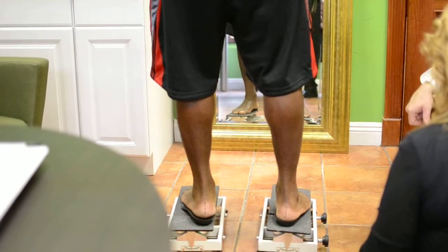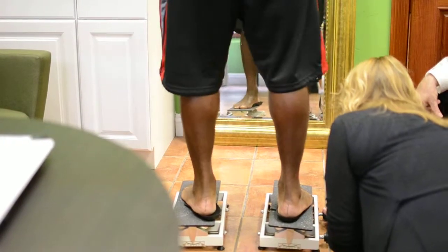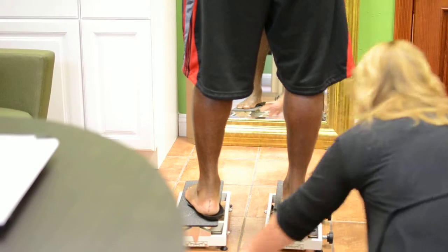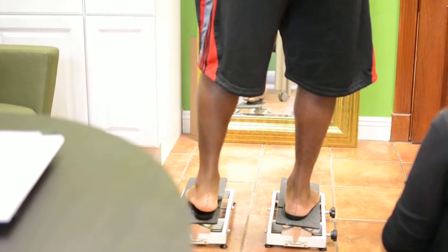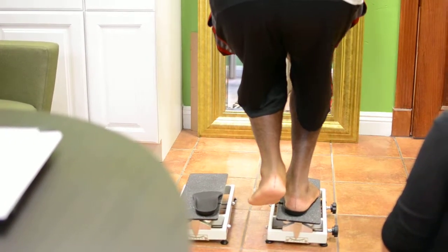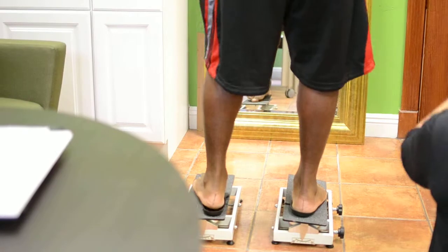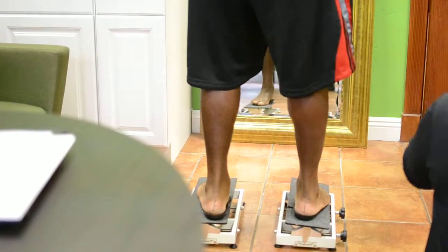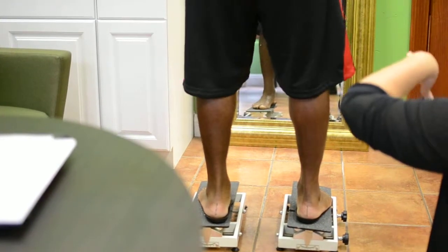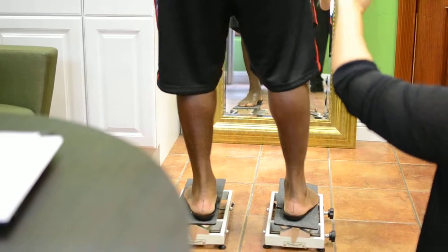We want the least amount of work that the foot is going to do. Do you feel like you're falling out at all? No. Can you rotate at your hips — just twist your whole body side to side? Watch up here — once we set this left side we should get better hip excursion out of this as well.